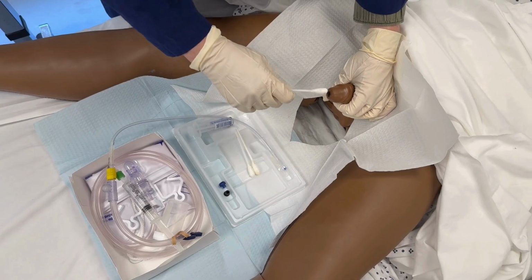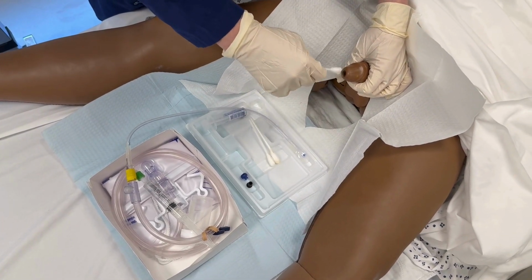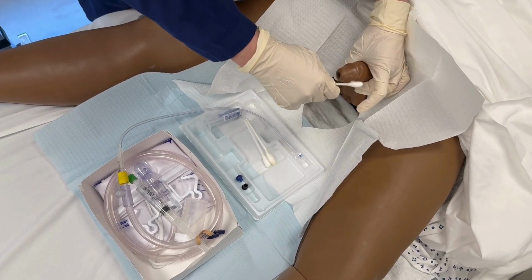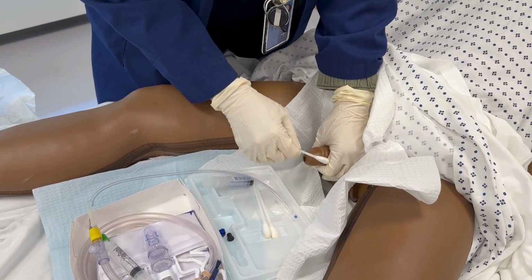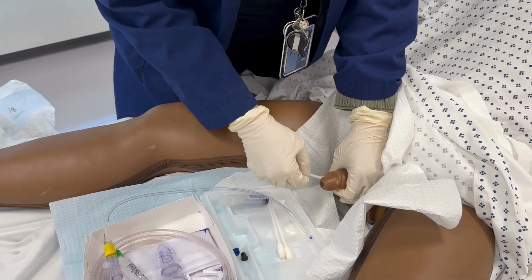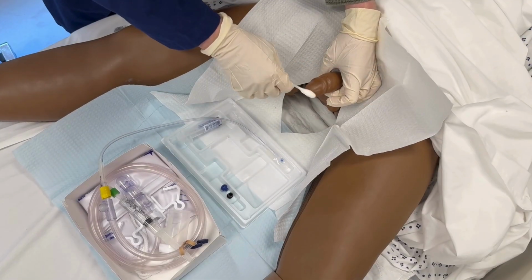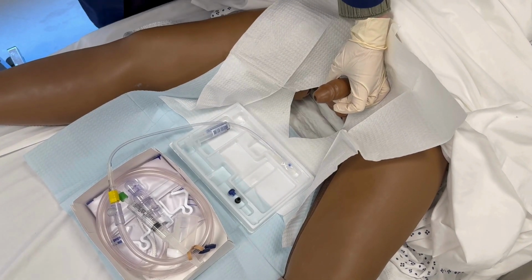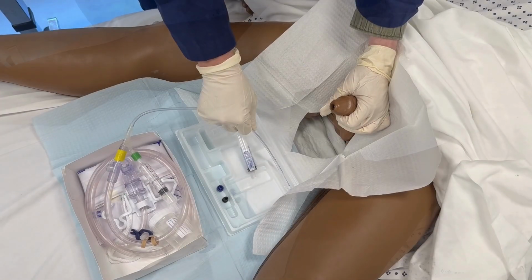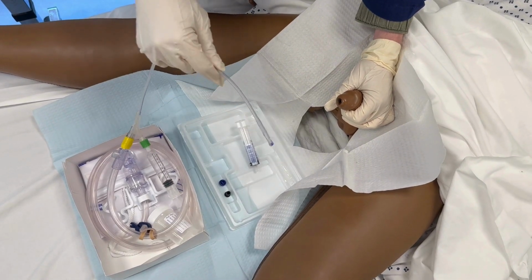With your dominant hand, pick up a new sterile antiseptic swab and clean the penis in a spiral fashion, moving from the meatus down the glans and discard. Still holding the penis with your non-dominant hand, apply a gentle upward tension.